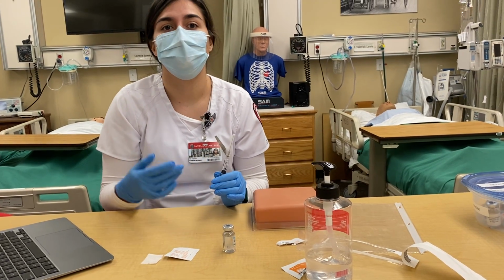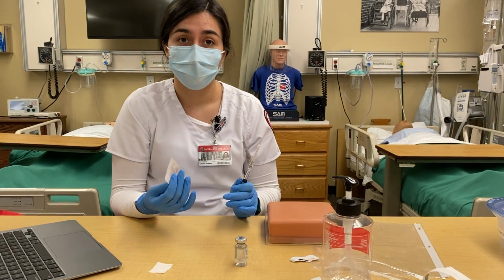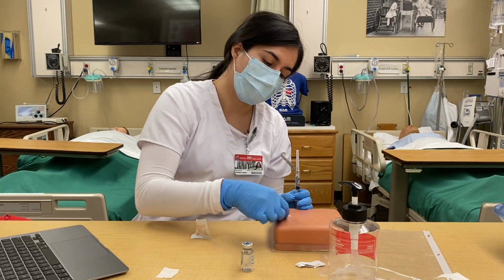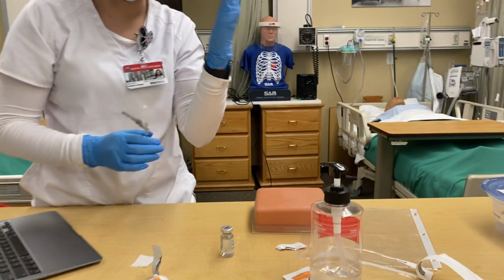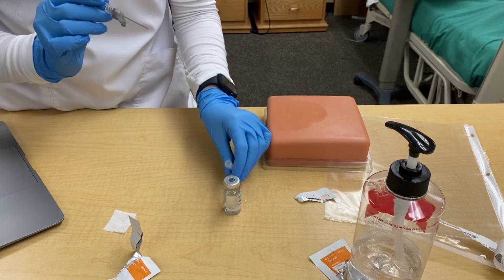If they refuse, then I will document refusal of medication. I tell them what I'm giving and what it is, and then I'm going to go to the injection site. I'm going to go ahead and clean. Since this is Z-track, I'm going to pull the skin back with this arm. I'm going to go like this. So I'm going to take this off.